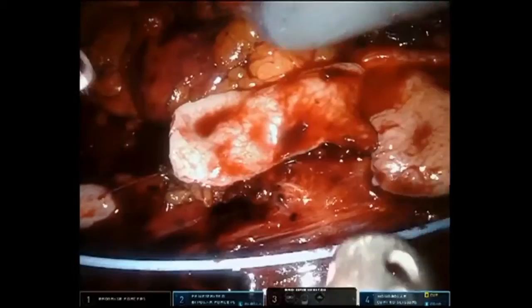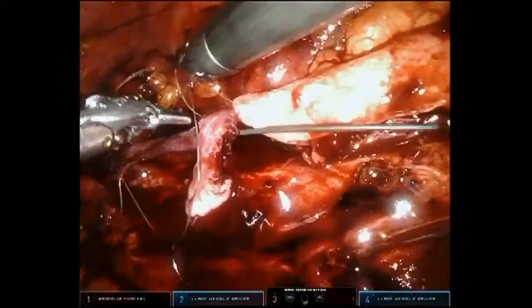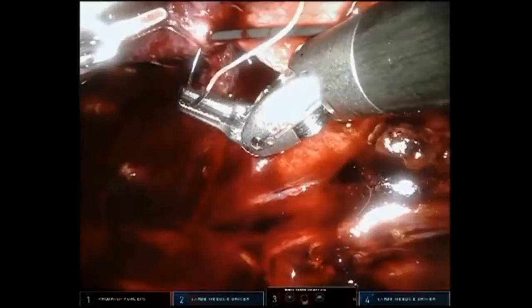A 4-0 suture was used to anastomose the heel of the spatulated ureter to the most caudal portion of the renal pelvis rotational flap. A running anastomosis ensued on both sides of the spatulated ureter, ensuring mucosa to mucosa apposition. Care is taken not to handle the mucosa of the ureter to avoid tissue damage.